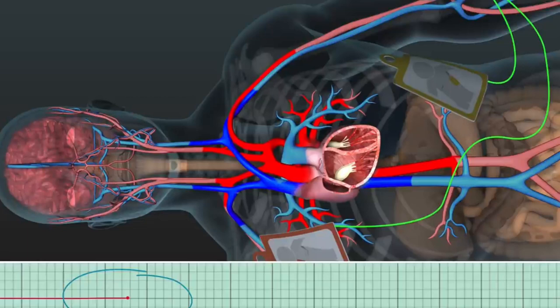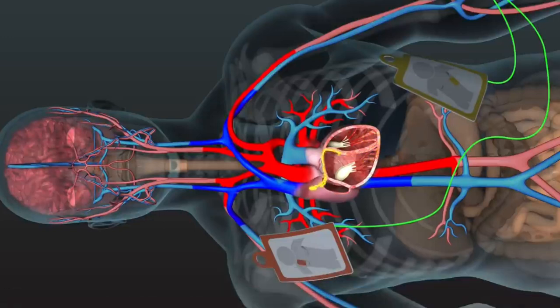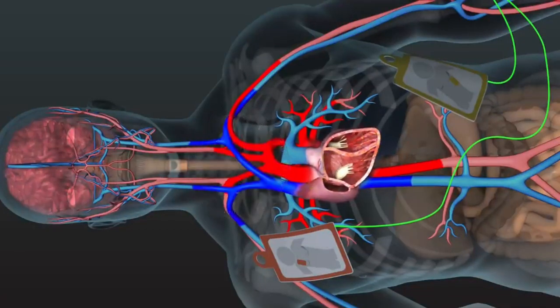Notice how the shock stopped all the electrical activity in Steve's heart for a brief period. Seconds after this shock, our own SA node, the pacemaker of our heart, will try to regain control of the heart and tell the rest of the heart when to squeeze. It can take up to 2 minutes for the heart to reorganize itself electrically after a shock, before it will function again and effectively pump blood to the brain.